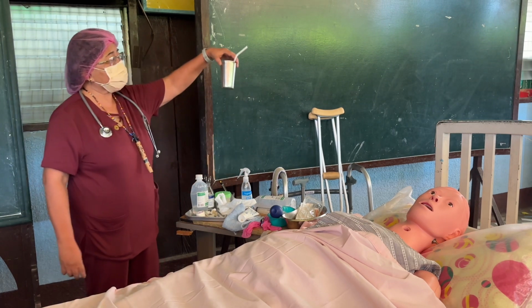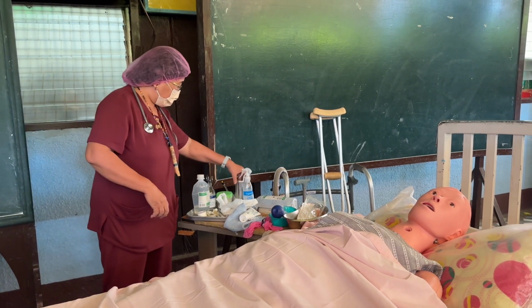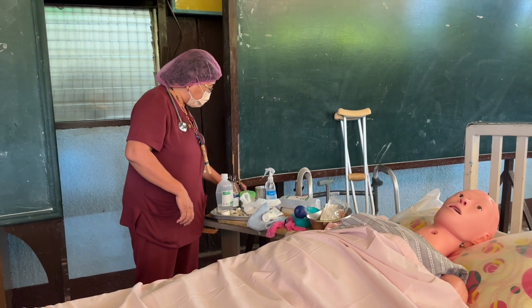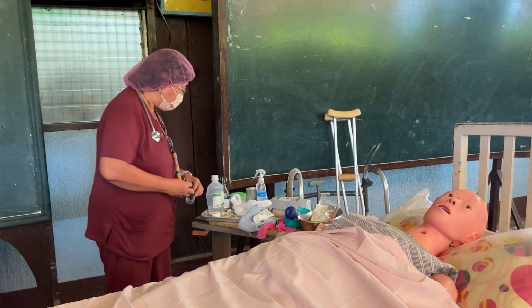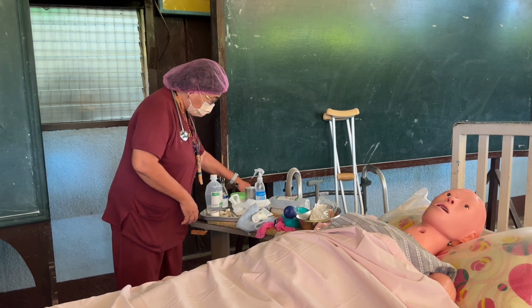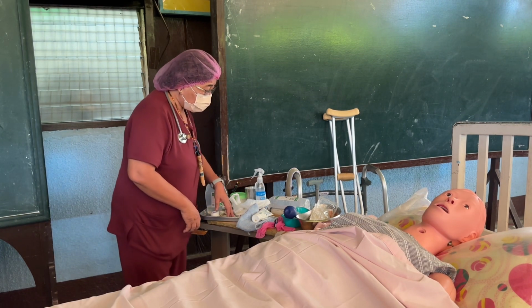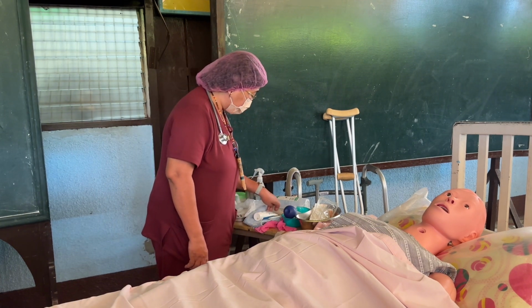We have a glass of water with a drinking straw, and then a medicine glass for the patient's ordered medication, and also cotton balls with water and dry cotton balls. So these are the things we're going to use during insertion.